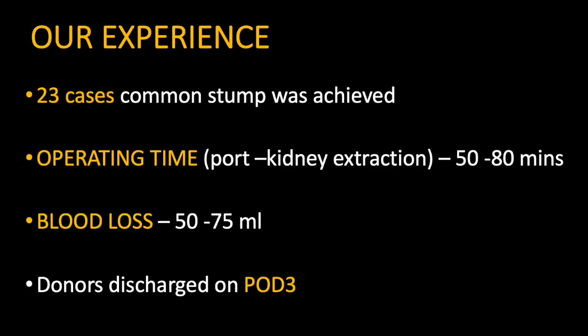In our experience, in 23 cases, common stump with adequate length was achieved. Total operating time, that is from port placement to kidney extraction, was between 50 and 80 minutes. Total blood loss was between 50 and 75 ml, and all our donor patients were comfortably discharged on POD3.